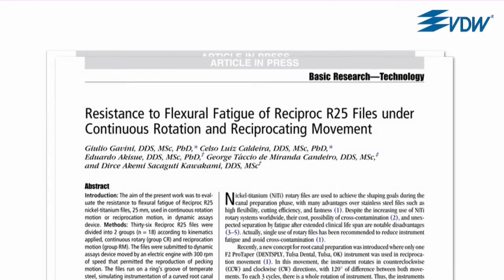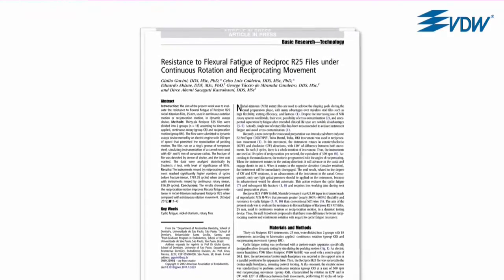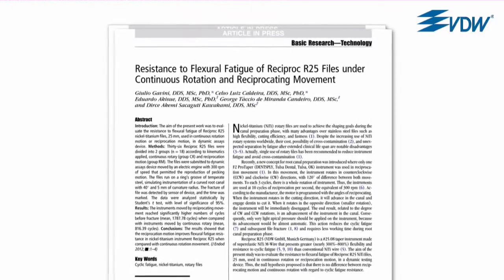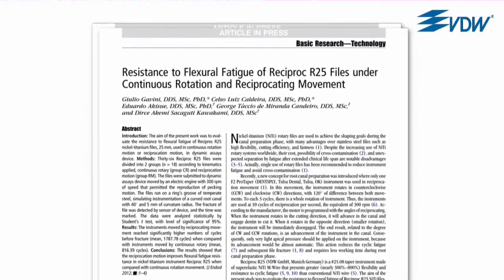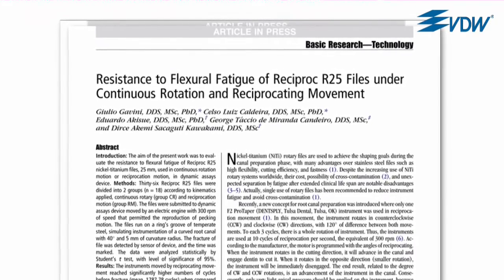Cyclic fatigue is caused by the repeated tension and compression of the instrument, for example in a canal curvature. Studies show that an instrument is subjected to significantly less cyclic fatigue in the reciprocating movement than in continuous rotary, which means there is a reduced risk of fracture due to cyclic fatigue.